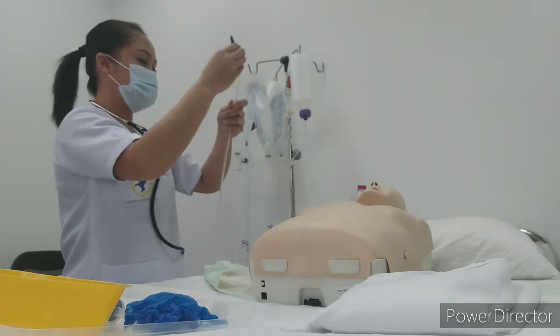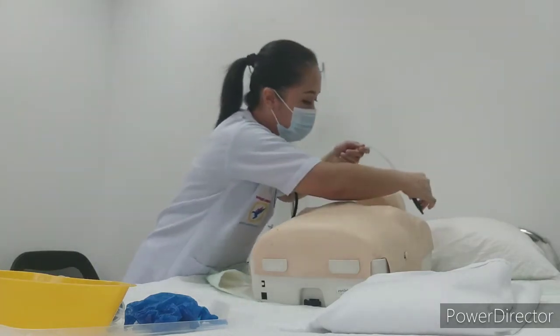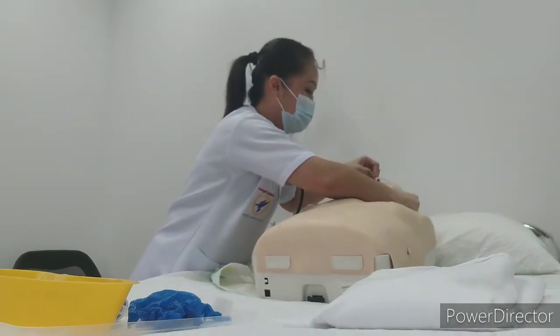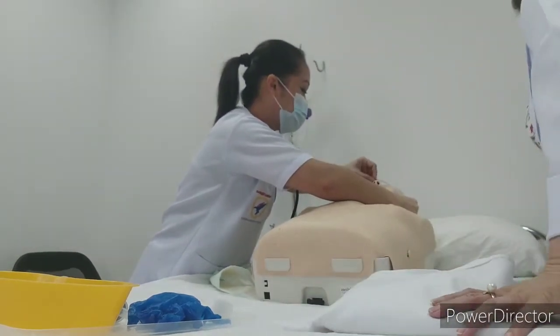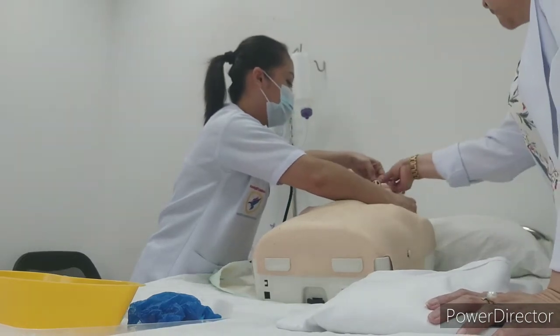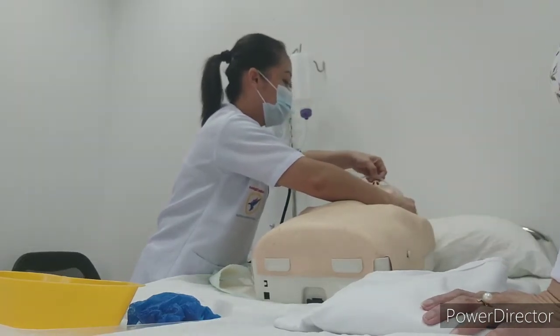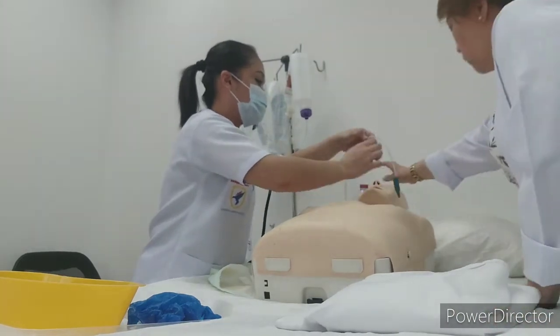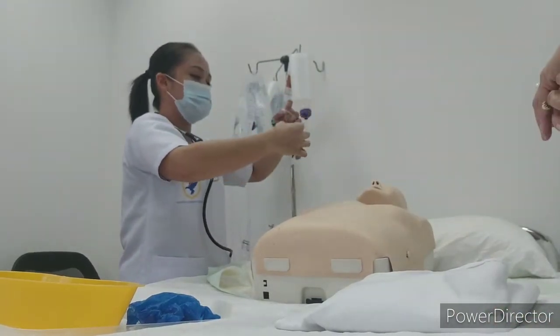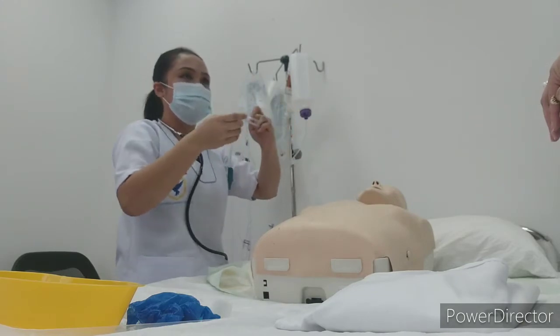We will do this like measuring from the earlobe of the patient to the nose tip of the patient. And then there is a number indicated on the tube so that it will be easy for you to identify. If the tube is very long, you need to roll it like twice, just leave 4 to 6 inches of it.